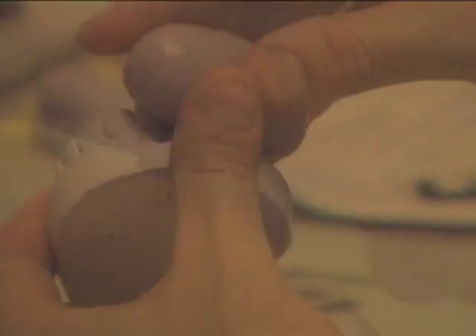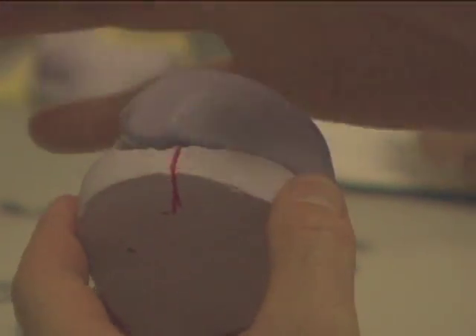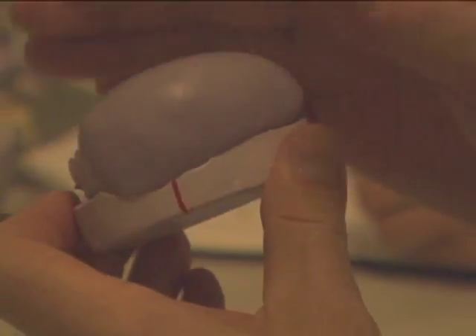Place the putty on the occlusal surface and work down over the buccal and lingual, covering the clasp. Make sure you work the putty into all areas very well so as to pick up all fine detail. When you have the putty in place, observe the red lines.